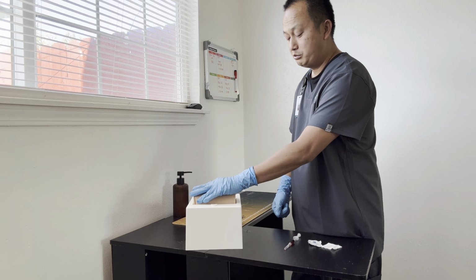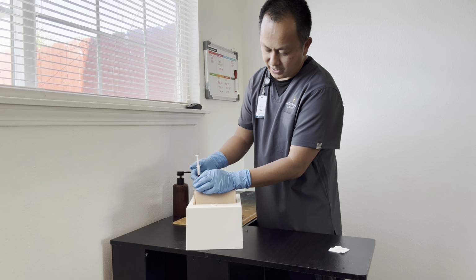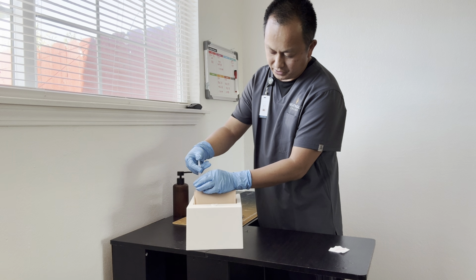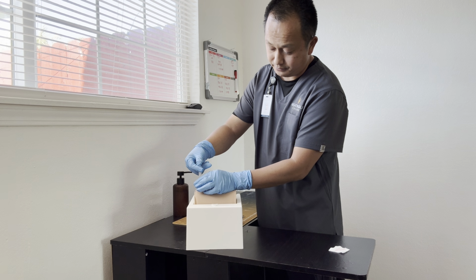And then once our site is dry, we're going to take our syringe, uncap it. We're going to use our non-dominant hand here to pinch the site. We're going to hold it like a dart and then go in at a 90-degree angle. Once the needle has pierced the skin, we're going to let go of the pinch and stabilize the syringe with our non-dominant hand. We're going to push the medication in slowly, 1 ml every 10 seconds. Once the medication has been pushed in, we're going to continue to hold for another 10 seconds.